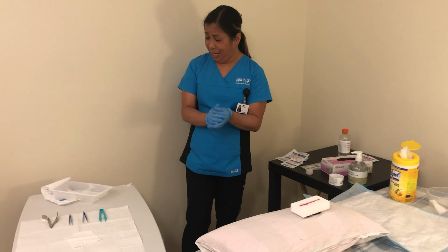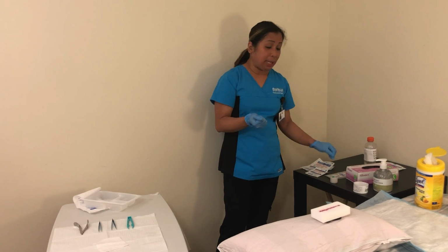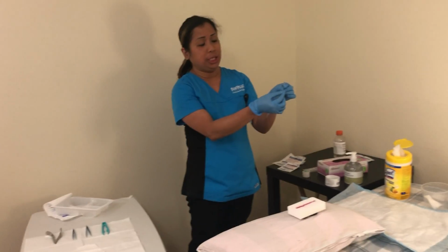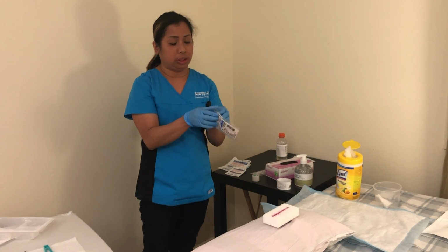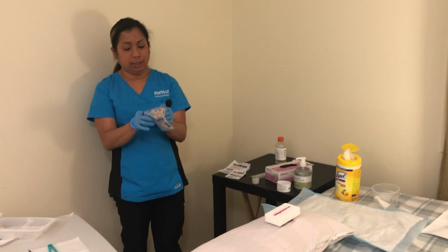Now I'm done removing the staples. What I'm going to do next is apply steri strips. I'll grab this one. Assuming it's not yet open, the expiration for this is August 2024. You still have to open it like a banana peel.